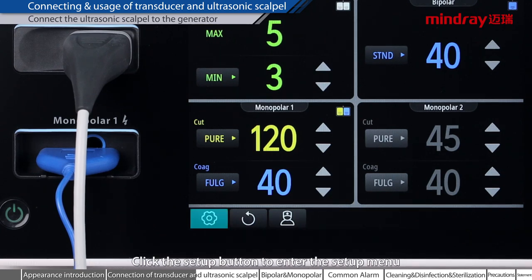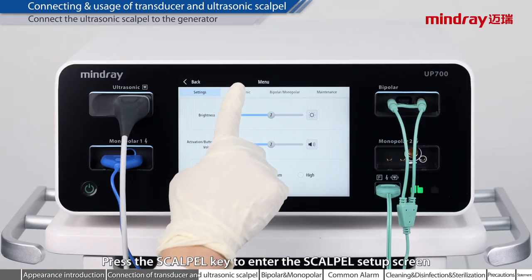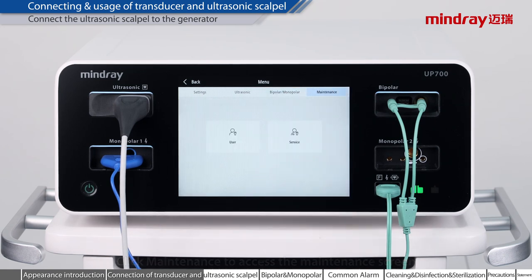Click the setup button to enter the setup menu. Press the scalpel key to enter the scalpel setup screen. Click the ESU button to enter the ESU setup screen. Click Maintenance to access the maintenance screen. Click Back to return to the main screen.